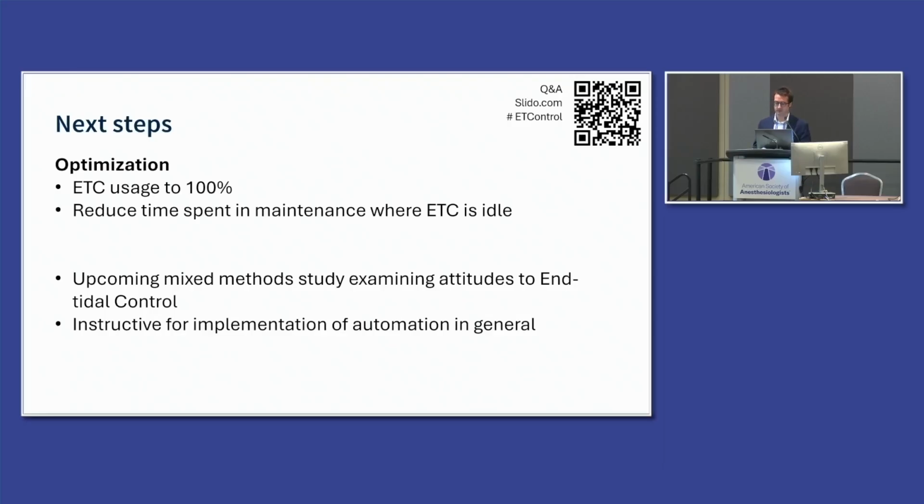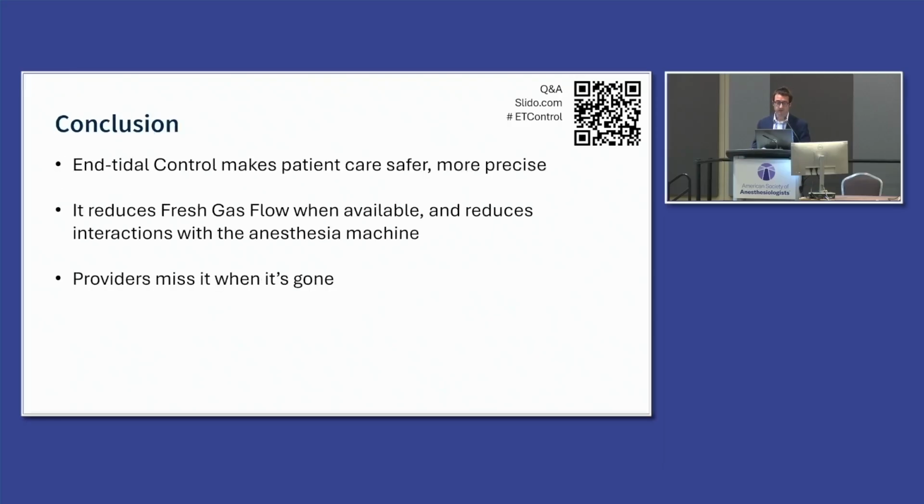So I think in conclusion, it's pretty clear that end-tidal control makes care safer, more precise. It reduces fresh gas flow. It does exactly what it says it should. And when you take it away, providers really miss it. And I think for me, that's the most instructive part of the whole thing.